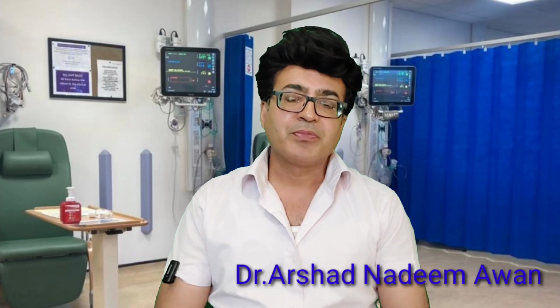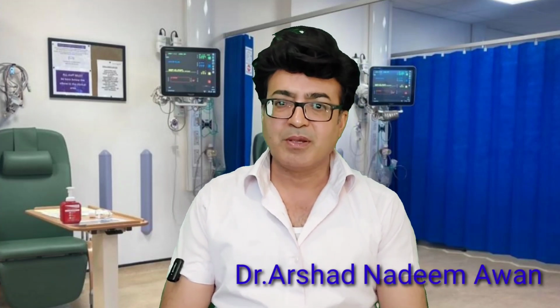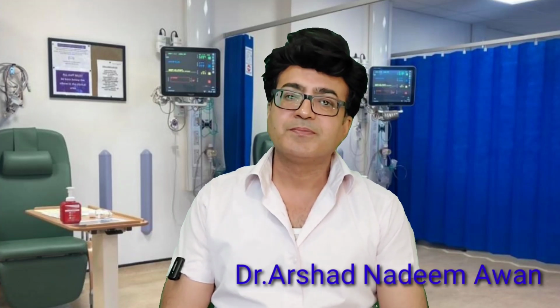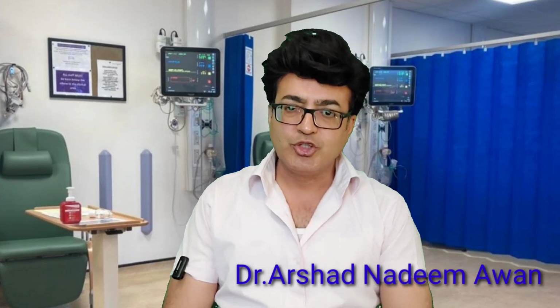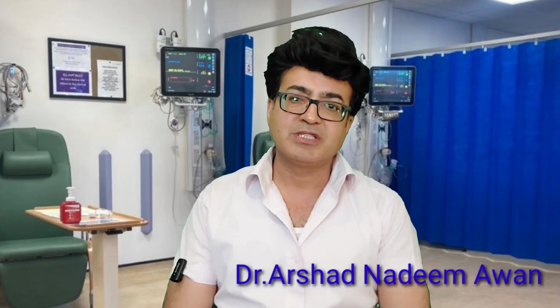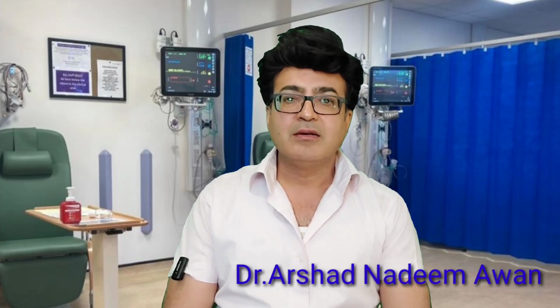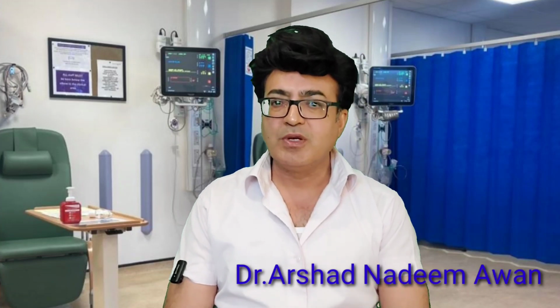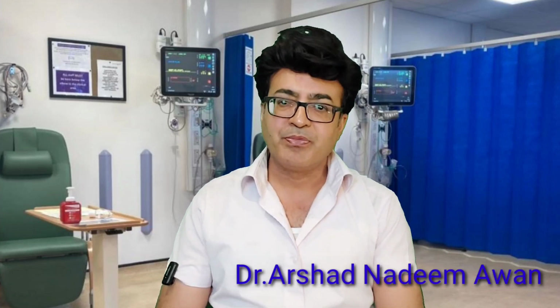But to some extent, on ultrasonography, you can also pick up some important information regarding ovarian vein thrombosis. Ovarian vein thrombosis appears on ultrasonography as a tubular structure adjacent to the uterus, anterior to the psoas muscle. It will appear as a tubular structure having low-level internal echoes of thrombus, echogenic thrombus within the lumen, which is normally anechoic. The appearance would be the same.